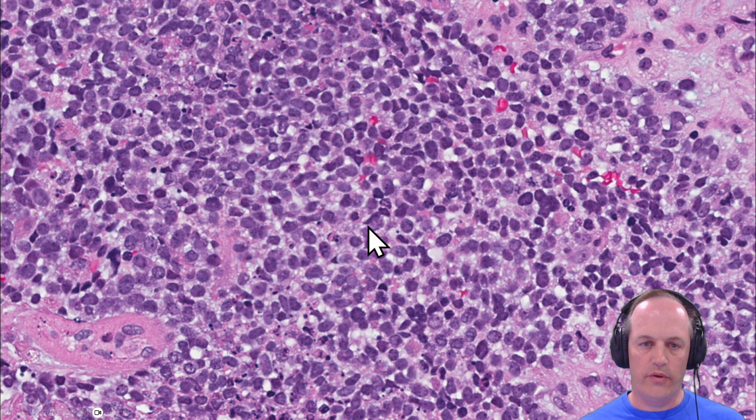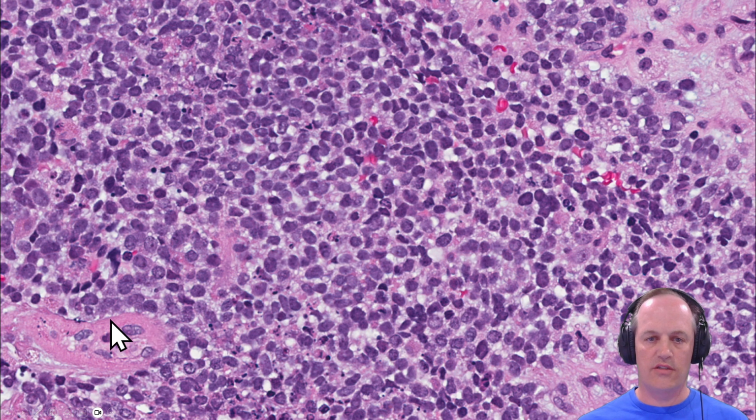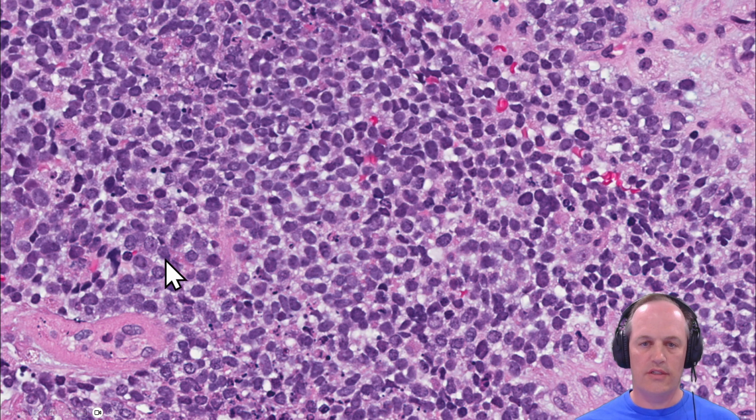And also, if you'll notice in the background, there's a number of these darker, angular cells that are generally at the edges of the nests, maybe even along vessels. David Parham taught me this. If you can identify these cells, that is a really great tip-off that this is a Ewing sarcoma. You don't see those cells in a whole lot of other things. So this combination of that cytology that's very monotonous with the foamy cytoplasm and these darker angular nuclei always gets Ewing to the top of my differential when I see something like this.